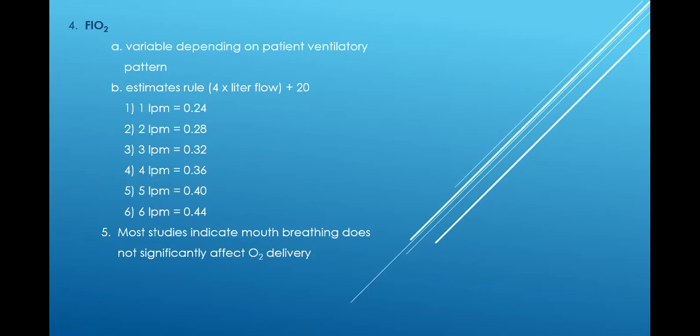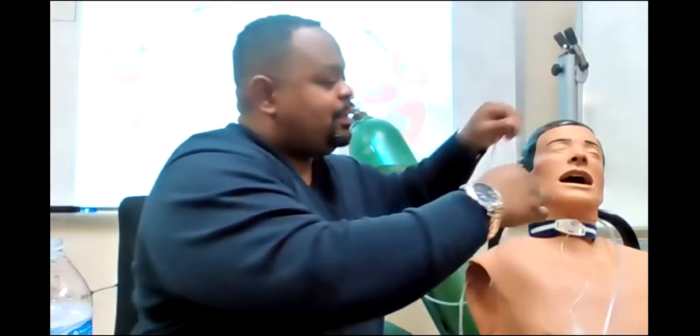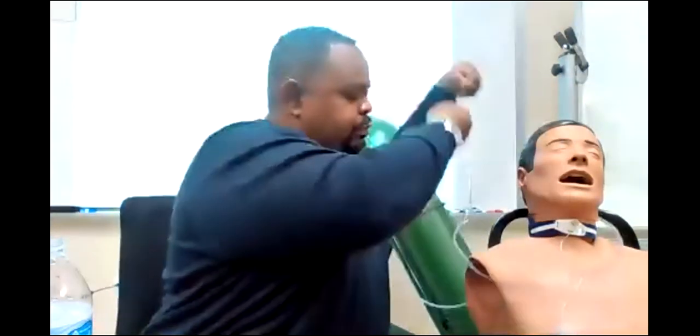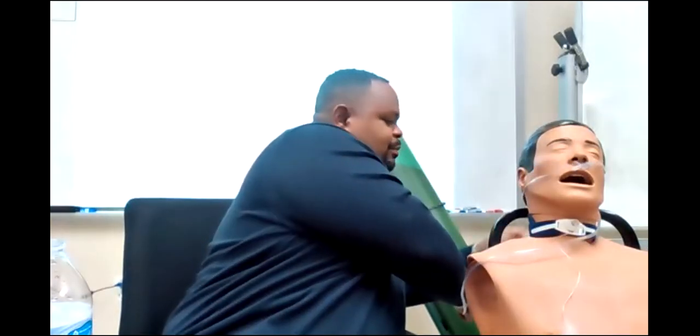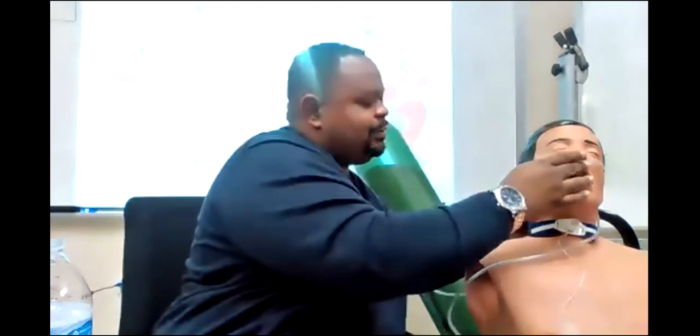So if I put this gentleman here on 1 liter, if I put oxygen in his nose, nasal cannula, right? If I put this man here on 1 liter, about what's his FiO2 on 1 liter? 0.24 or 24%, okay? 0.24 is 24%.